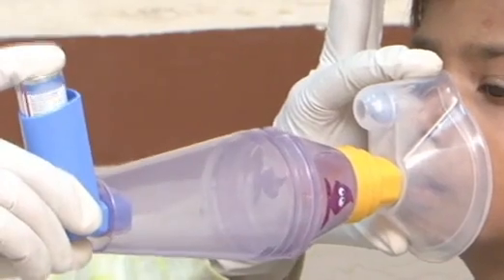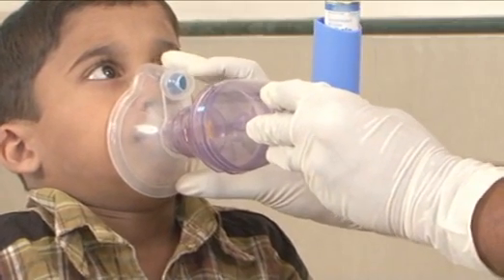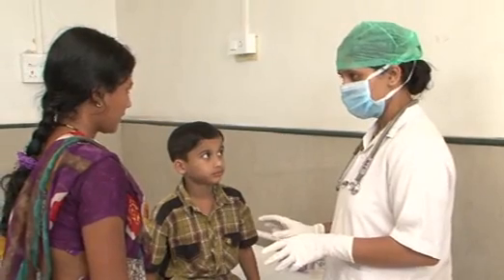If a single dose needs more puffs, press the canister again and advise the child to breathe. If a child needs another dose, it should be given as per doctor's direction.